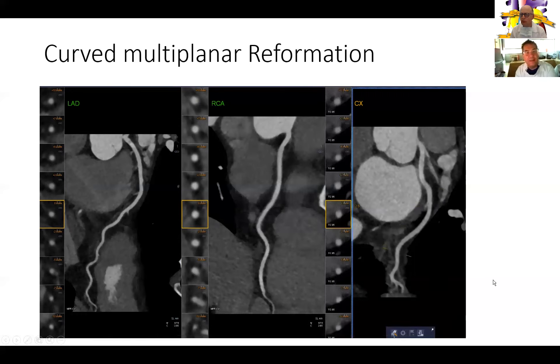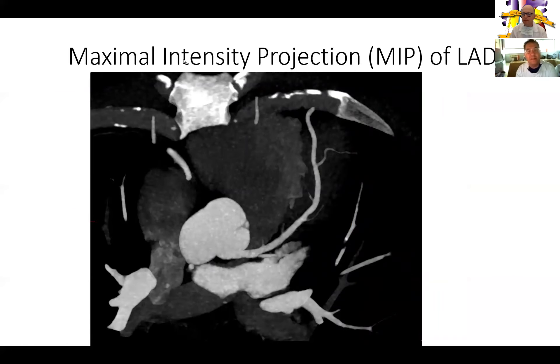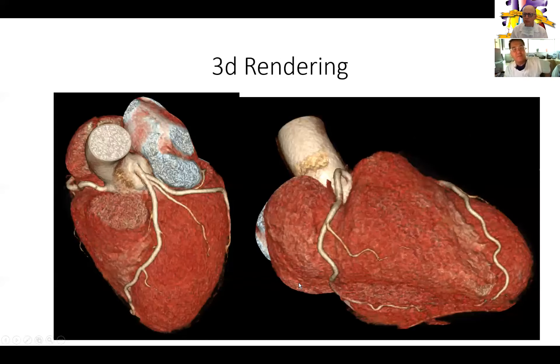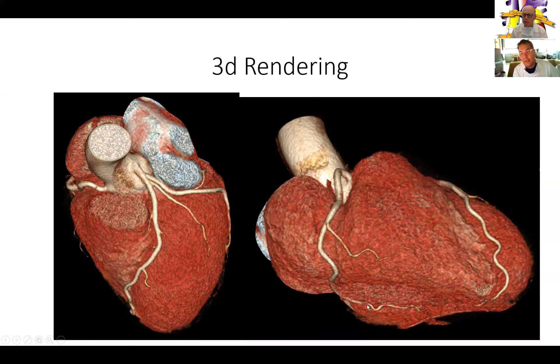Finally, there is another format: the maximum intensity projection (MIP). This is a thick slab of slices where the computer selects the maximal intensity. It is not very helpful for identifying specific lesions, but very useful for visualizing long segments of the artery and seeing all the segments and branches. It is very nice for pictures and displays fistulas, anomalous origin of the coronaries, and the different branches such as the ramus or the diagonal. You can see the origin of the right and the left coronary very well, and rotating the image shows the RCA and its distal branches.